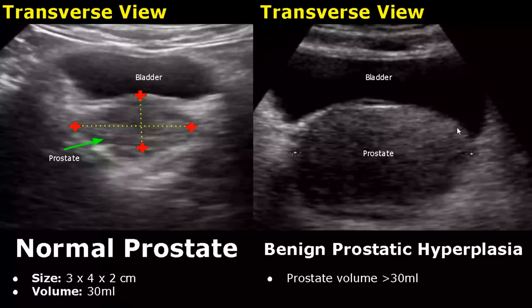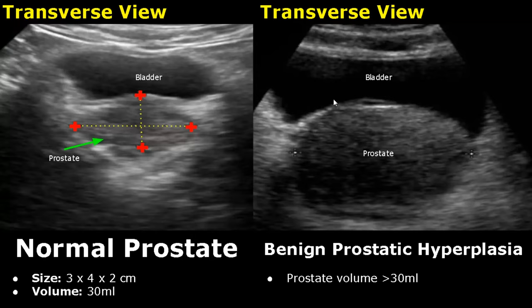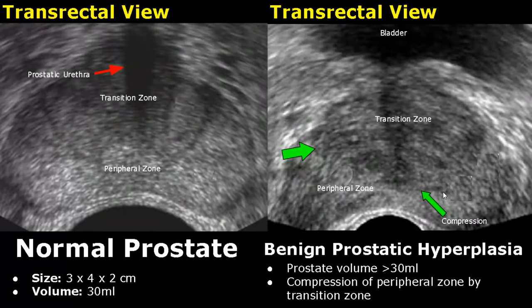Benign prostatic hyperplasia is an abnormal enlargement of the prostate. The prostate volume will be greater than 30 ml. We can see an enlargement of the prostate here. In a transrectal view we can see more detail. BPH occurs in the transition zone and we can see compression of the peripheral zone by the transition zone.